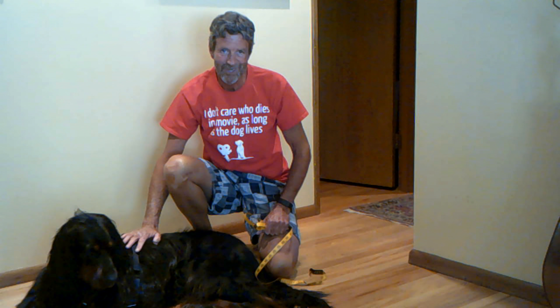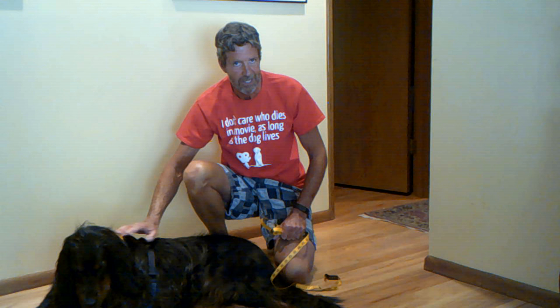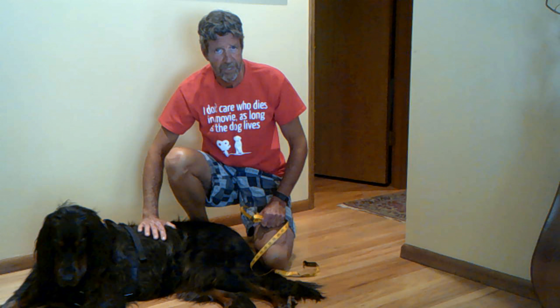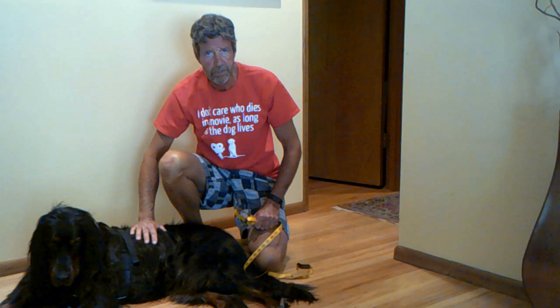So that's how you measure your dog for the anti-knuckling device. If your dog has hind limb weakness or knuckling problems with his back legs — or her back legs — we hope to hear from you. Thanks so much for watching.